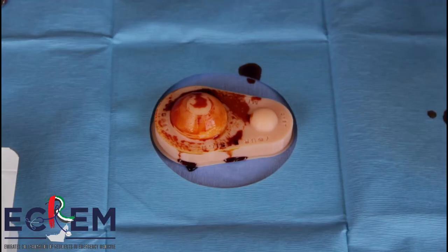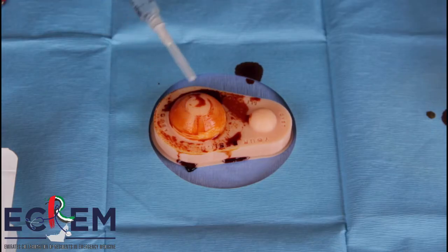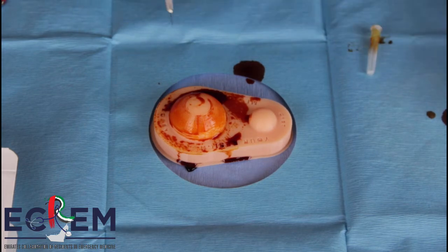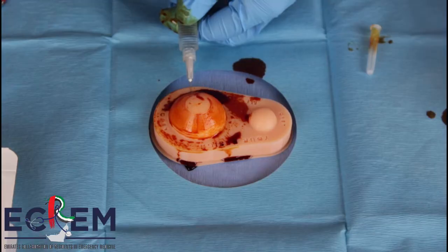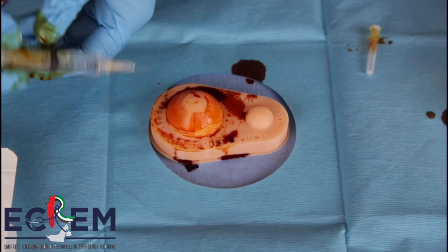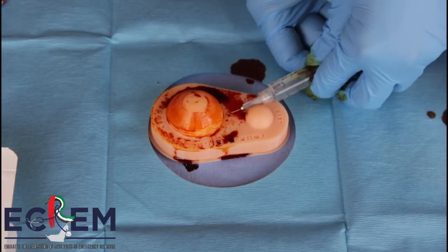Next, you take the local anesthetic. You'll be injecting the local anesthetic around the wound, not on the abscess — it is around the area. You make sure you are aspirating before you inject. So you aspirate and then inject. Again, you aspirate, inject. Same on the other side — aspirate, inject. Aspirate, inject.